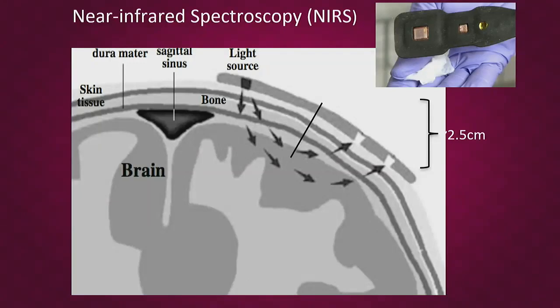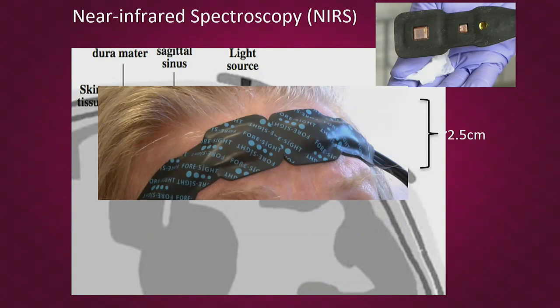So how does NIRS work? You have a NIRS light source, usually between 600 and 900 nanometers. The photons travel, you see in those two banana arc paths. On the right, what you see is a short detector and then a long detector. And so when we say that it's spatially resolved detection, what we mean is that some of the photons are measuring the scalp tissue, and the deeper one is the deep tissue. So you subtract those to understand what is the underlying brain tissue's optical density units.